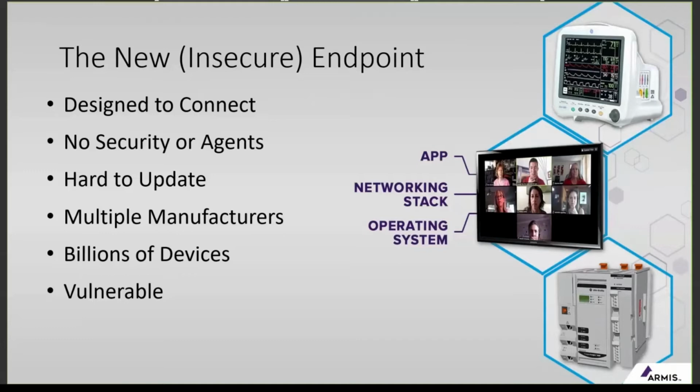Devices themselves are hard to update. And unfortunately, we've seen this, and Dor will speak to some of this in today's session, where in some cases, we've actually spoken to manufacturers where they are able to patch an exposure in a device that's allowing for attacks to happen within a healthcare environment, but they don't because they're quick to realize that the process to update those devices is time-consuming, problematic, requires the devices to be physically touched, someone to do something with the device itself. So they haven't released patches in some of these cases, or if they have, in many cases, unfortunately, downstream, folks have had a hard time applying them or just haven't applied them for many of those reasons that I just mentioned.